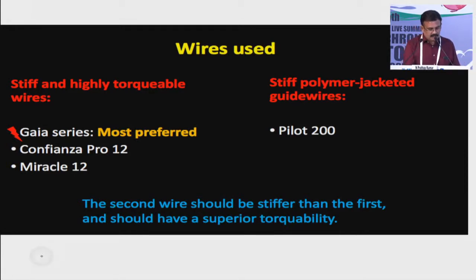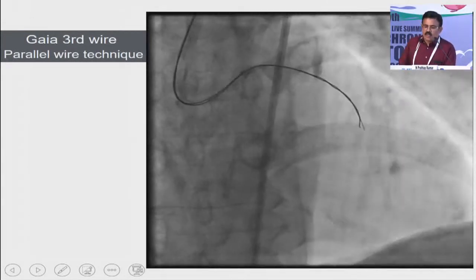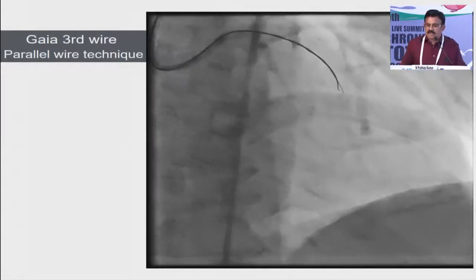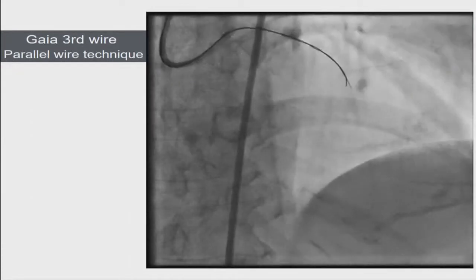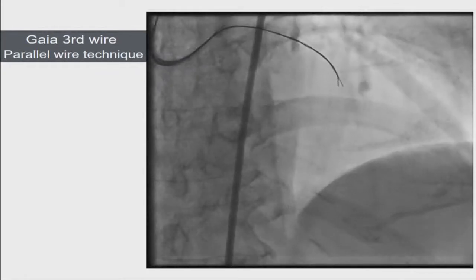So in the present case, I kept my wire in the totally subintimal track. I've taken a third wire, that's actually a Gaia Third wire. With the Gaia Third, you can see the distal wire, now the wire is redirected into the true lumen. So I'm just rotating and going down.